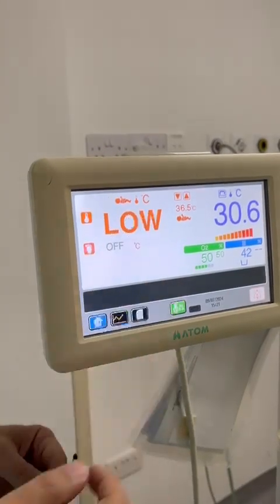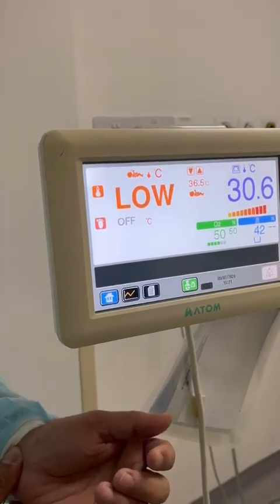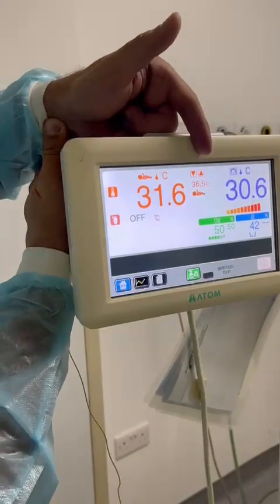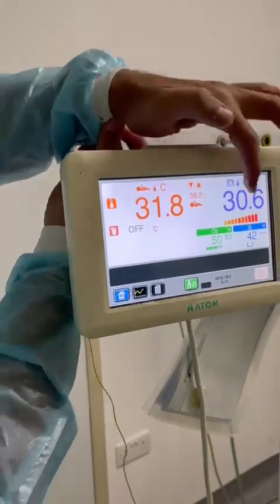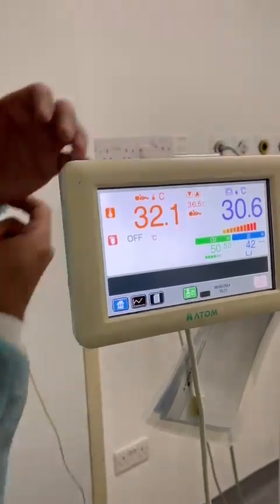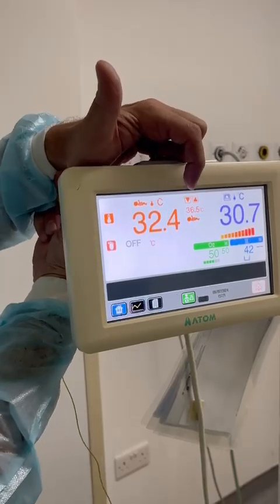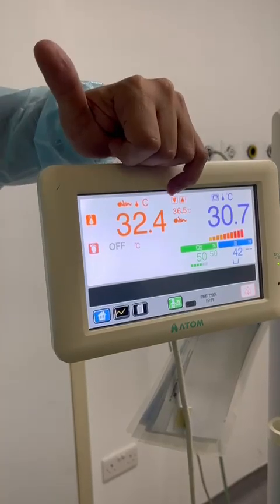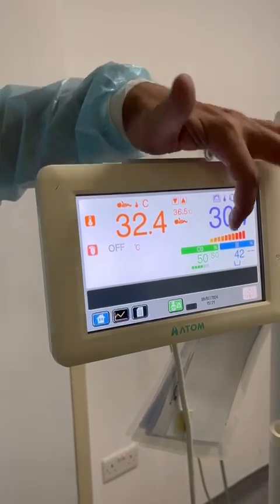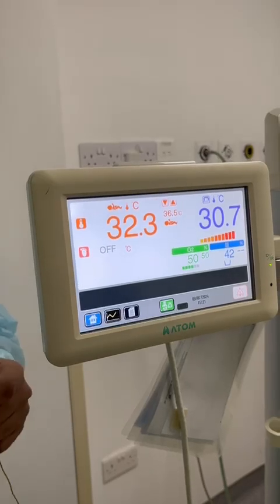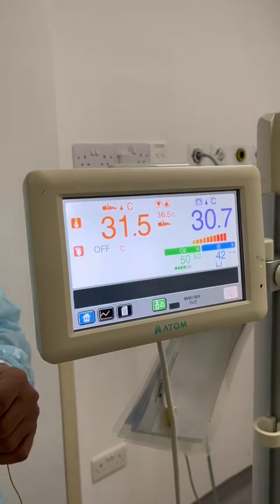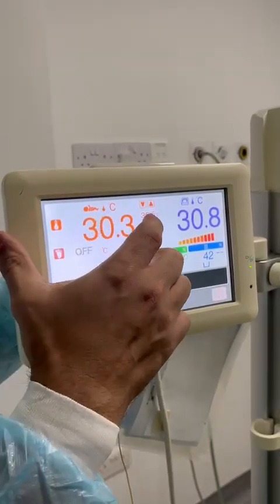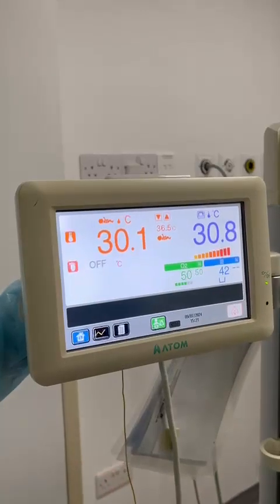Right now baby temperature is low — you can see it is 31.4 — that's why the heater is working at full capacity, because the actual baby temperature is far from the set temperature. You will see that once baby temperature reaches close to 36.5, the heater will gradually turn off. As a safety feature, if there is a variation between the actual baby temperature and the set temperature of 0.5 degrees, an alarm will be activated.